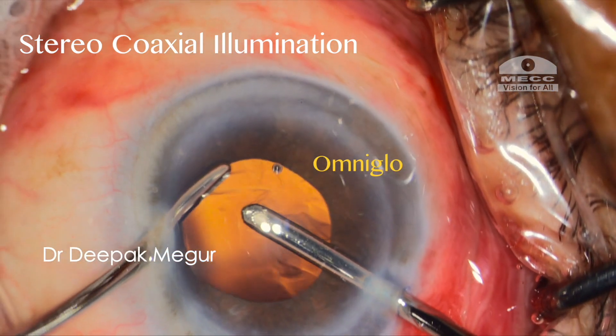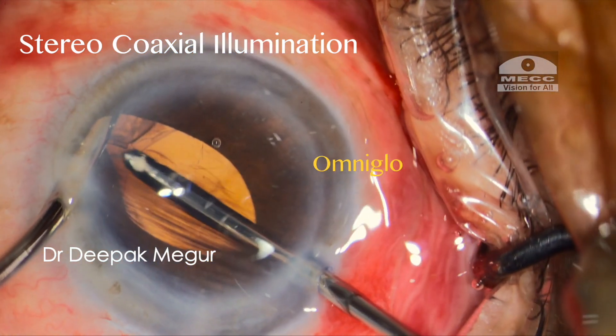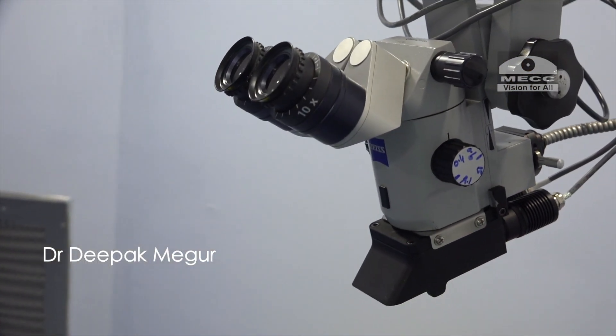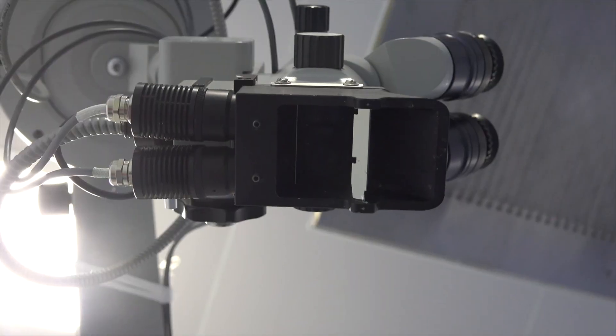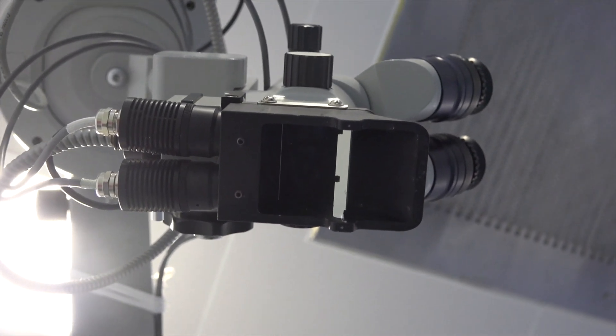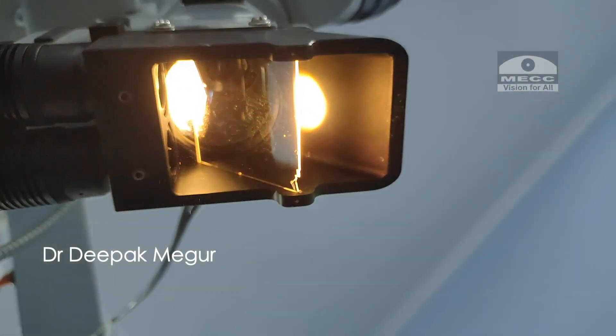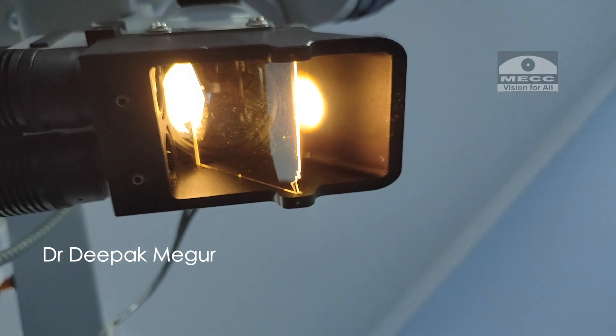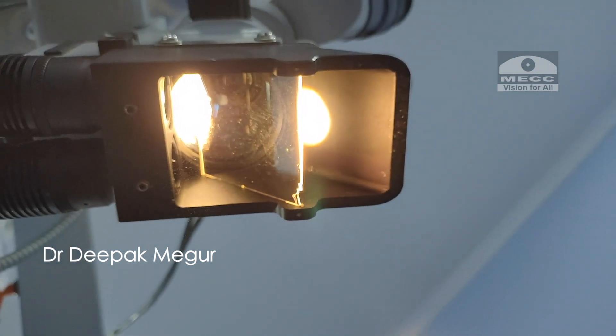Here is my brief review and impressions about this device. It's a small illuminating device which attaches to the bottom of the objective lens of the microscope. It has inbuilt LED bulbs which provide the illumination, the intensity of which can be controlled by the provided power regulator. And this is how it looks.